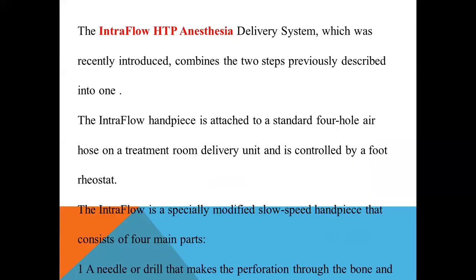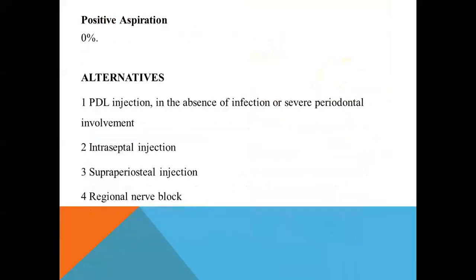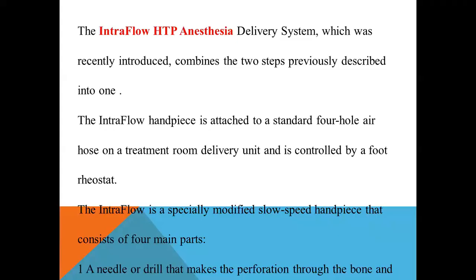As I told, a special needle has to be used. That is the only disadvantage of using this. This is the Stabident IntraFlow. I've shown a few points. I've added this to show you what this IntraFlow anesthetic system is. It's recently introduced and combines two steps.